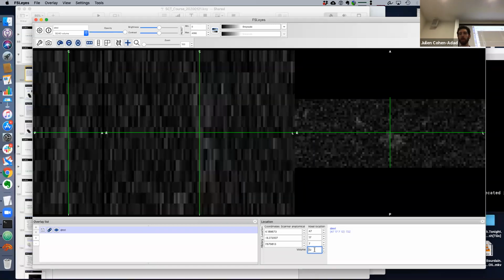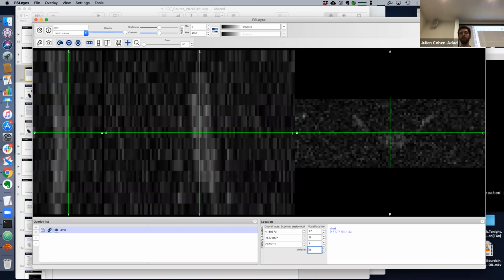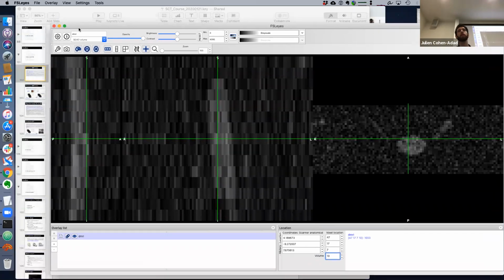With DTI, we basically take all those images and register them together to make sure, in case the patient moved during those several minutes long acquisition. And then we can estimate a composite score using a particular model, such as the diffusion tensor model, for example.